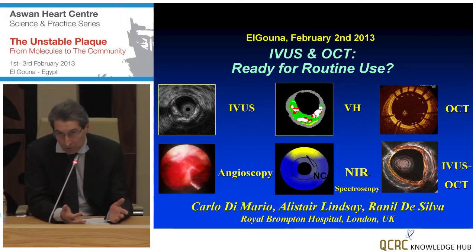What seems somewhat worrisome is that, from both experimental data and some initial OCT series, there is no other method but OCT to assess neoatherosclerosis in stents late after stenting. The phenomenon seems to occur earlier and more frequently in drug-eluting than in bare metal stents. However, saying what the absolute prevalence of the phenomenon is, I think it is early to say; it has been mentioned and around only in the last 1 to 2 years.